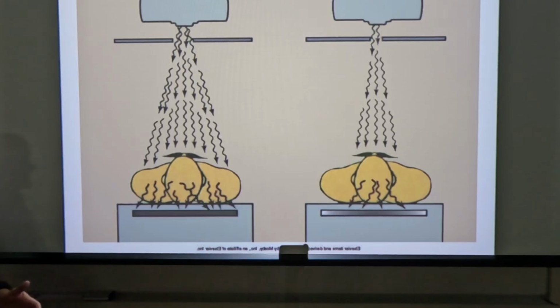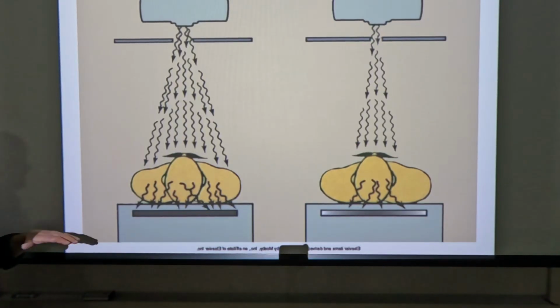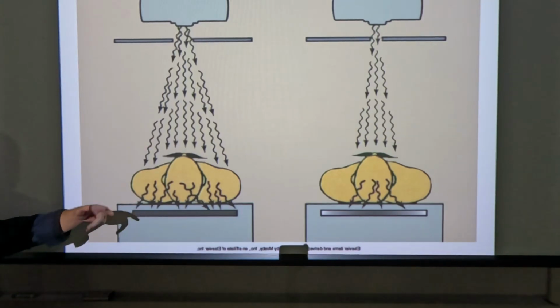Not the best example here, because a lot of your radiologists and especially ER doctors want you to shoot the entire chest for T-spine, for reasons that we'll talk about. But instead of collimating to the T-spine, you shoot the entire chest. Which one's getting more dose? Chest. Yeah, you do this every day for 6 months.